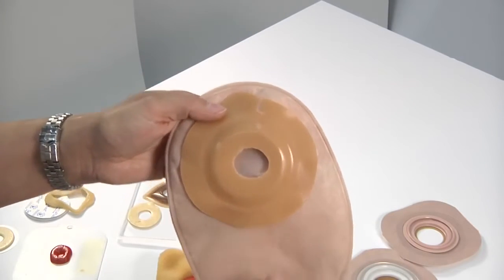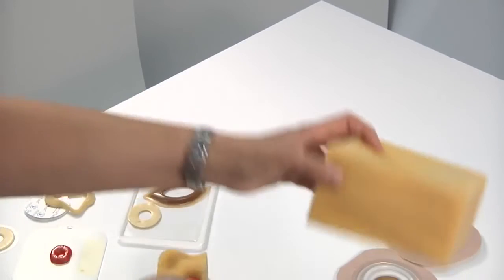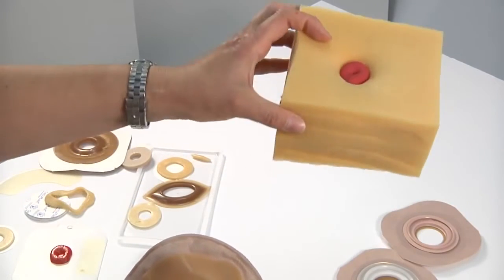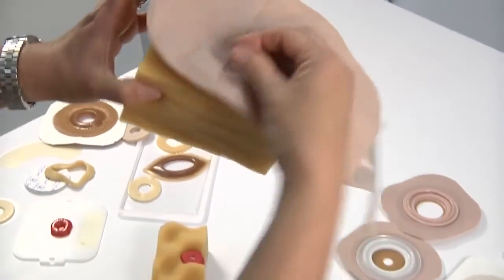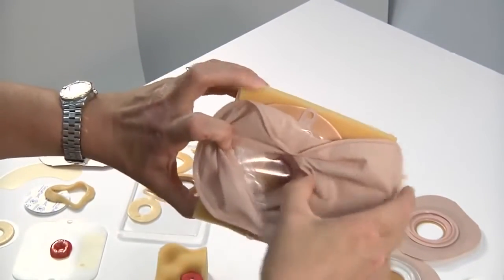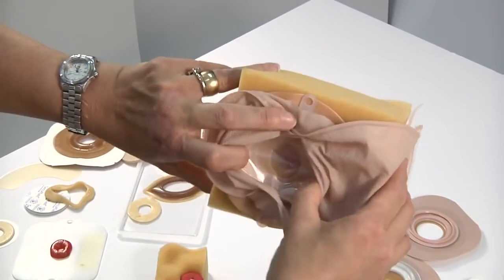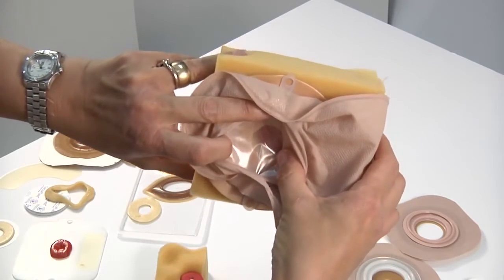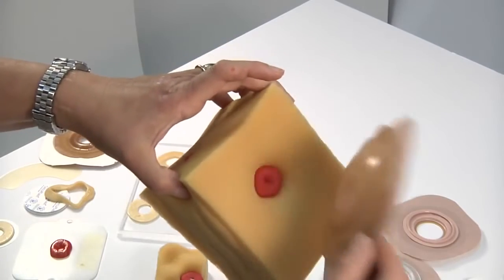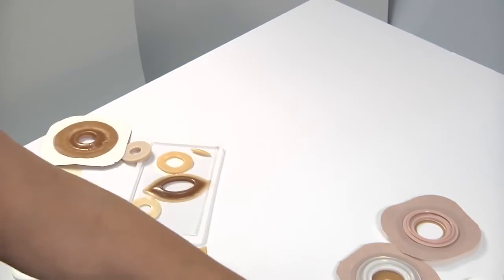But if you've got somebody that's got a deep gully, like this, where you can't even see the stoma when they're on a profile, you're probably not going to, if you look at the front here, when you open up that pouch, you can see that you've got a big gap right in there, and you're not actually filling it in. So this is not enough convexity for you. Okay.